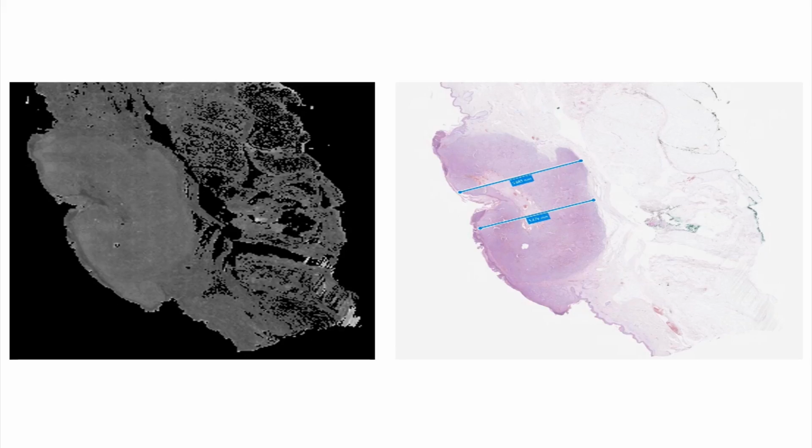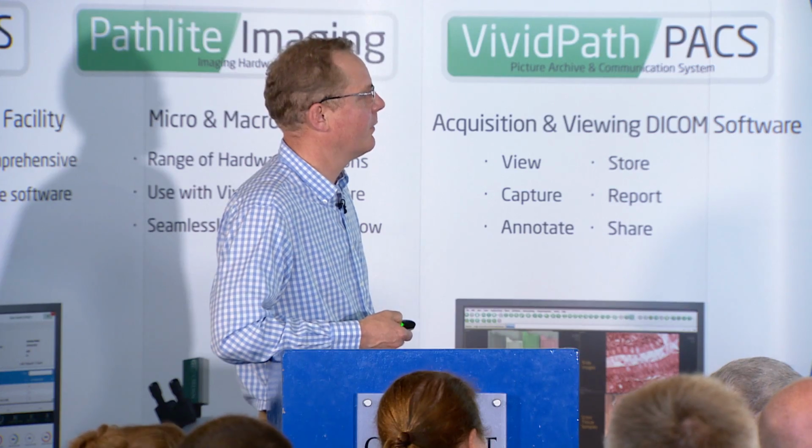That's interfered with the scanner's ability to focus on the tissue plane, and when you look at that area on H&E, at first glance it's difficult to pick up because it's mostly fat, so there's not much there. But the bottom half of this picture is perfectly in focus. And there's a line across the middle, and above that it's not quite in focus. It's good enough. You can see what's going on. There's nothing seriously wrong with it. It's just adipose tissue, but it's not in focus.